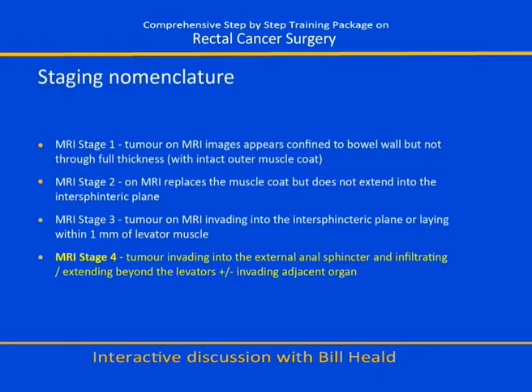You use staging there, stage 1, 2, 3. Yes. Is that your own staging? Well, it's one that we felt, rather than confuse things by calling it T-stage, it was better to define it according to the anatomy. Can you put words to 1, 2, 3 in the low rectum on MRI? Yes.